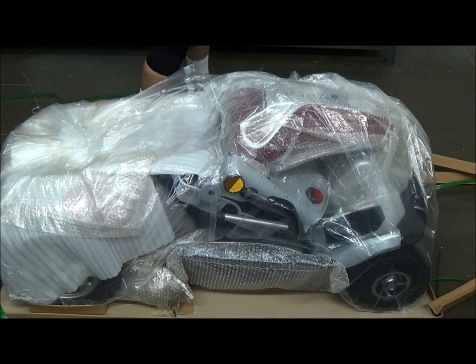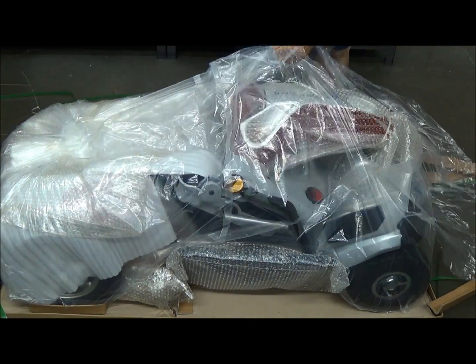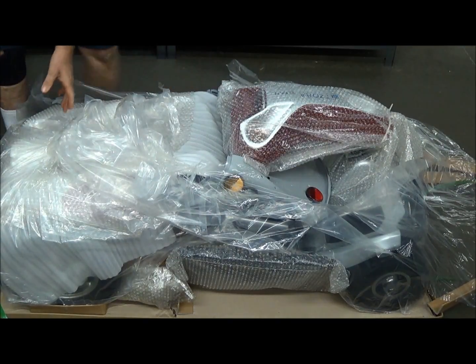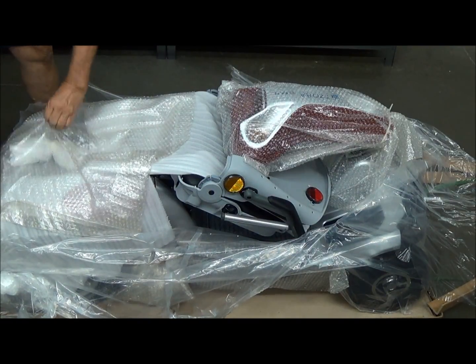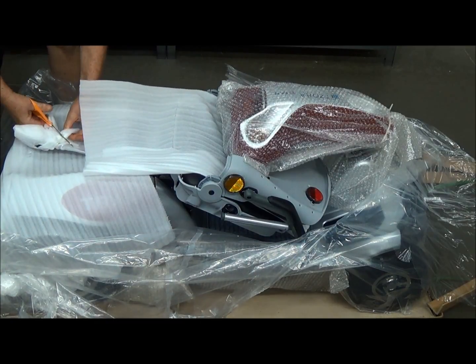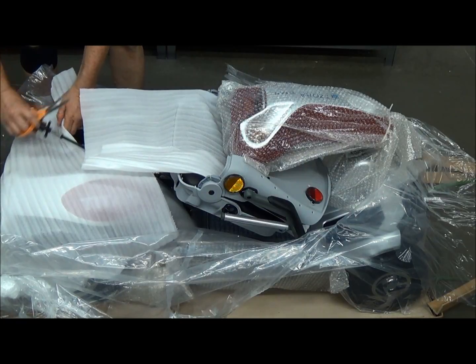So now you're just left with the scooter all bundled up in plastic. Just start with a nice sharp pair of scissors and start cutting all the plastic off. I find it's easier to use a good pair of scissors than a knife, because you don't have to worry so much about scratching the scooter or cutting yourself.